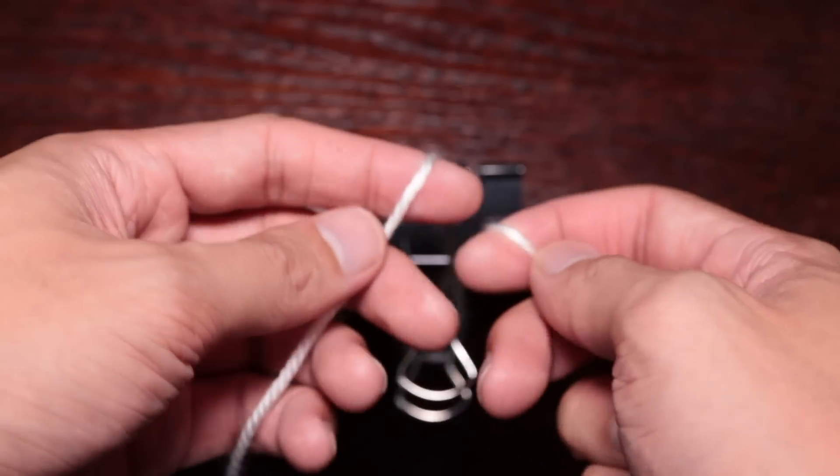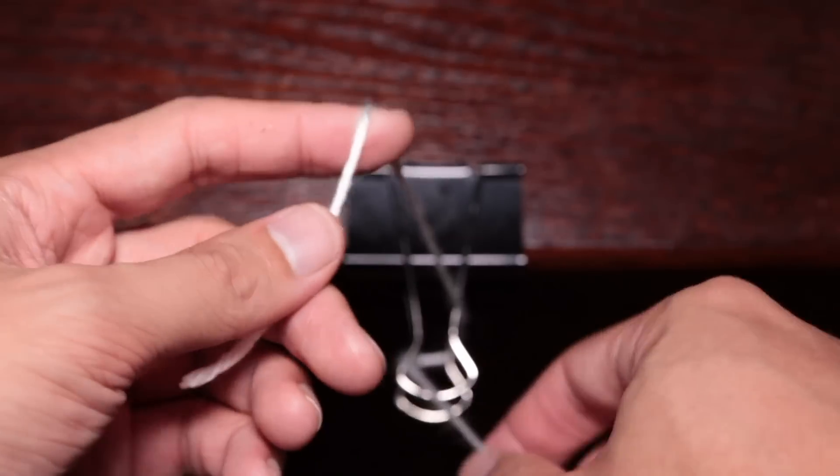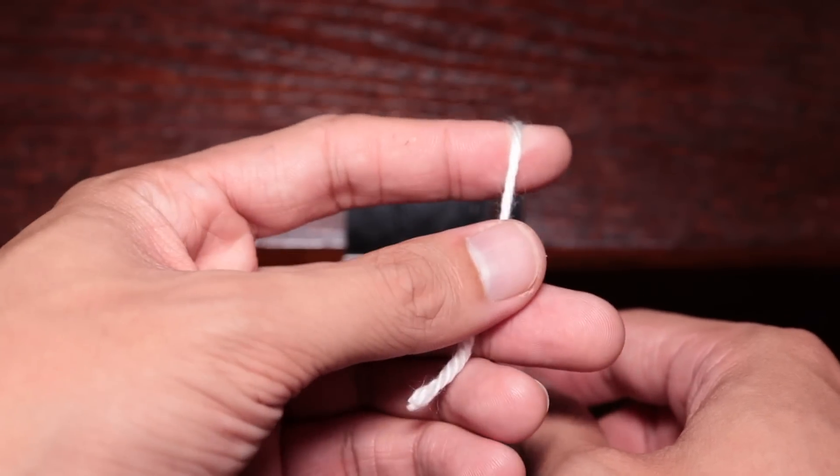You're going to start off with the free end in your left hand. Highly recommended even if you're left-handed or right-handed. Start with your left hand.